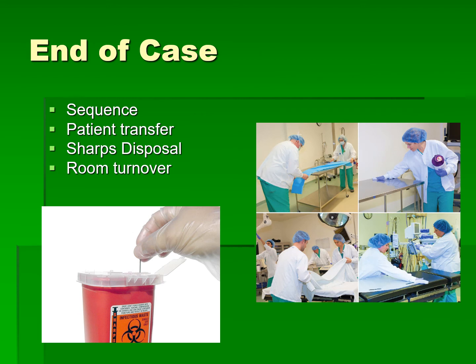And then lastly, after the patient is out of the room, you're going to first make sure that you've contained all of your sharps and disposed of them properly. Then it's a matter of breaking down your back table, opening up all of your instruments, disassembling any instruments, getting those to decon. And then coming back to help with the room turnover.